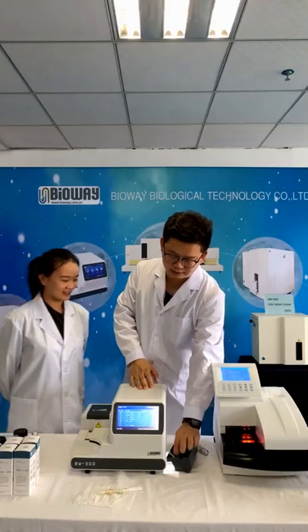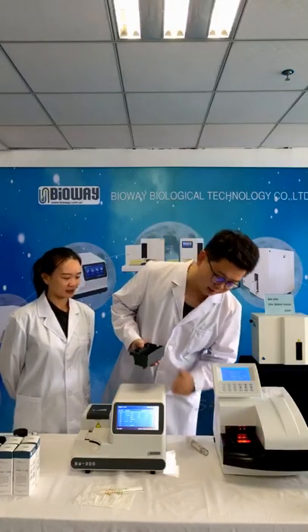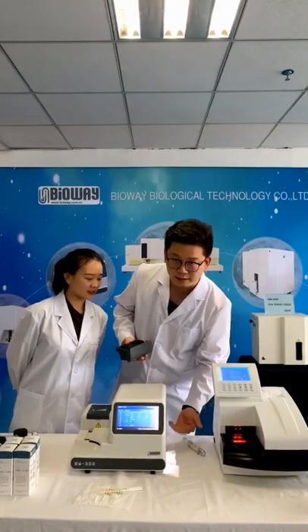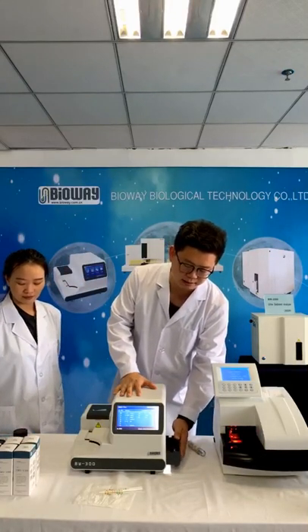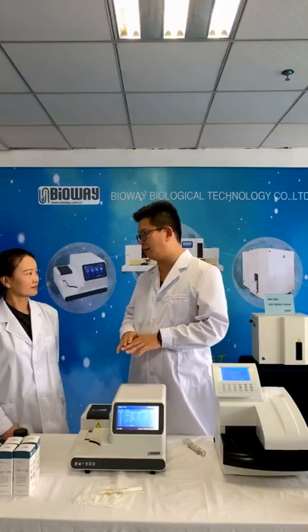It's dropped like this. You can see that? Oh, it's dropped into the collection box. And from the hole, you can see a white light. That means there's a dark box with white light. It's a standard condition, so the photos have been taken. There are totally no effects from the ambient condition.